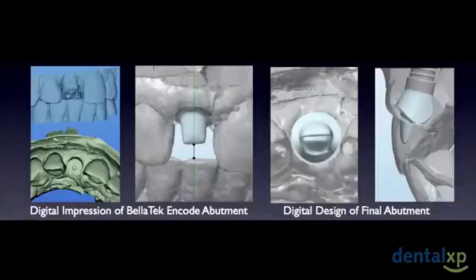We can see in these images the digital scan of the ENCODE abutment and our final design depicted of the tissues in all the different positions. This will give us an ideal position when we place our final abutment. Remember, we only take the ENCODE abutment out of the mouth one time, and that will minimize any change to the tissue.